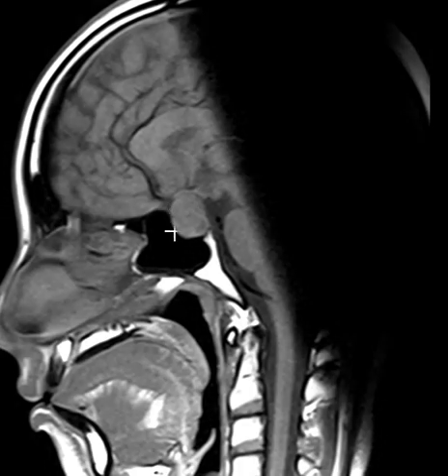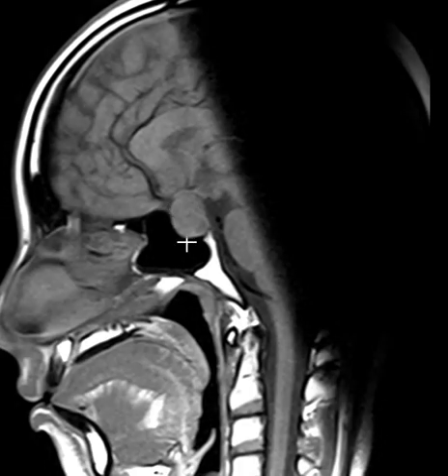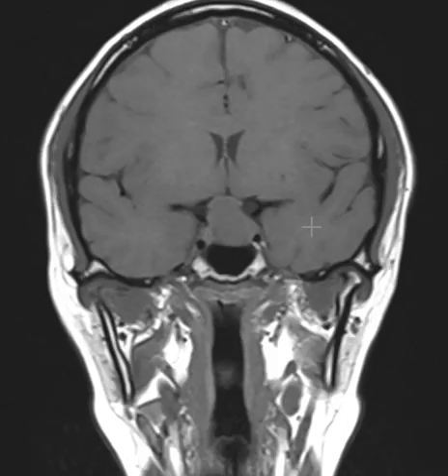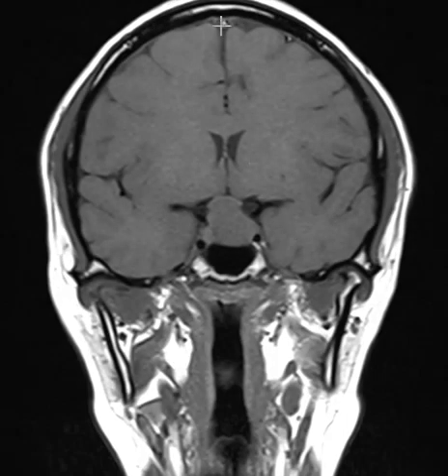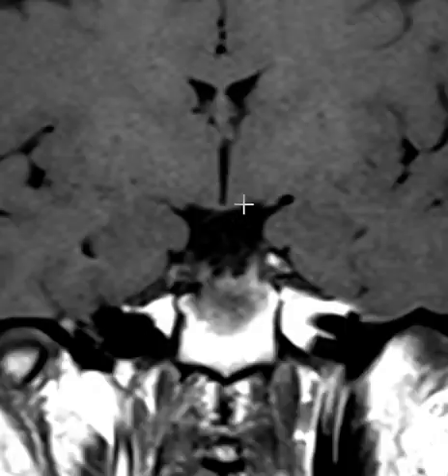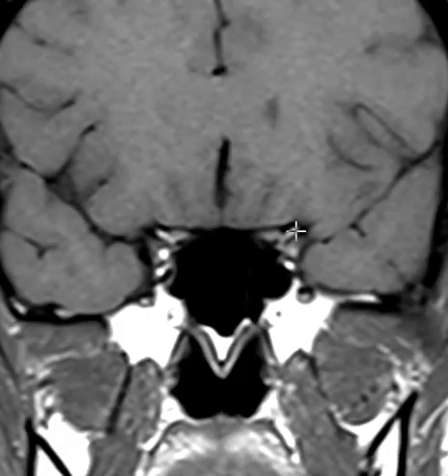Pushing on the optic chiasm is causing her visual disturbance. On this view we see the same thing — this is the enlarged pituitary gland and this is the cup, the sella. The sella is expanded a little bit and the pituitary mass comes up here and pushes on this line. Now we're looking straight on at the patient. Here's the top, right, left, and the enlarged pituitary gland is right here — this is a pituitary mass.